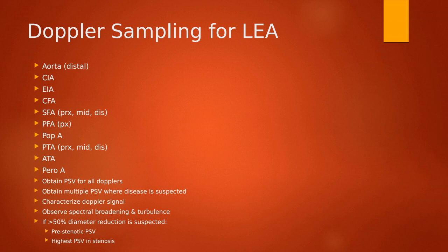We're also following that down a little bit further, getting closer towards the inguinal canal, to the external iliac artery. Remember the internal iliac artery, that other branch of the common iliac artery, also known as the hypogastric arteries from our quiz. That is something we don't really see, especially in patients who are bigger. So we're not really worrying about that internal iliac artery. Our common iliac artery comes down into our external iliac artery, coming down into the leg to the common femoral artery.